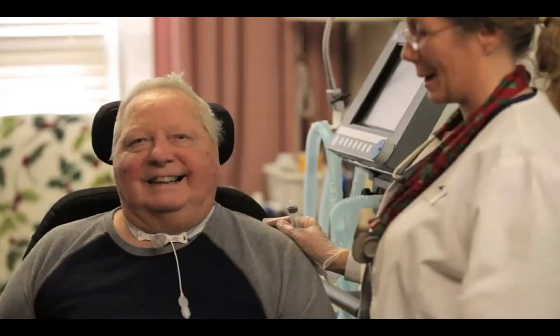And that happens a lot with patients who have been on a trach for a very long time. So if you put a speaking valve on a patient for the first time and there's no voice, that's okay, because probably this patient has been trached or intubated for a very long time, no airway circulation, his vocal folds haven't been moving for a very long time, his whole laryngeal muscles haven't been moving for a very long time. So it might need a few hours or days to restore that function.